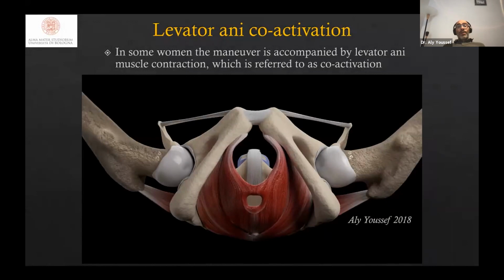center is first of all the association between the pelvic floor diameter, the anteroposterior diameter, and the mode of delivery, and the anteroposterior diameter and the duration of the second stage of labor. And we have seen that the shorter the anteroposterior diameter of the levator hiatus, both at rest and at pushing, the longer is the active second stage of labor.